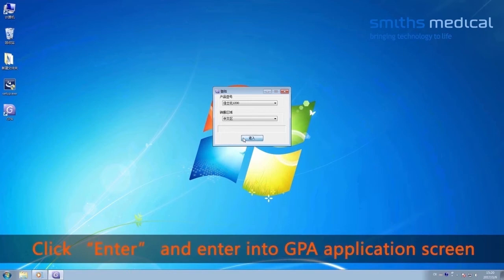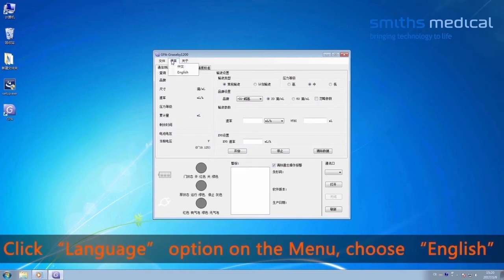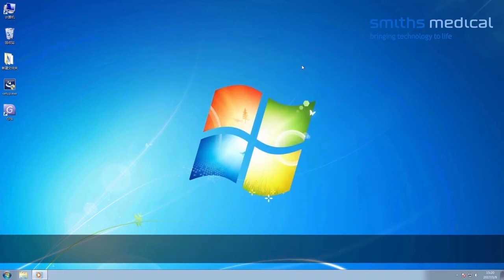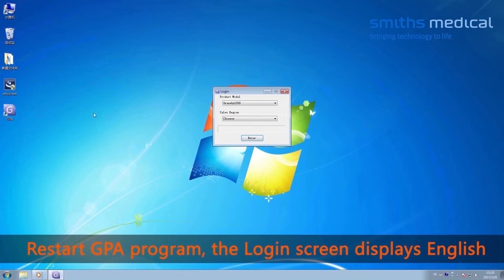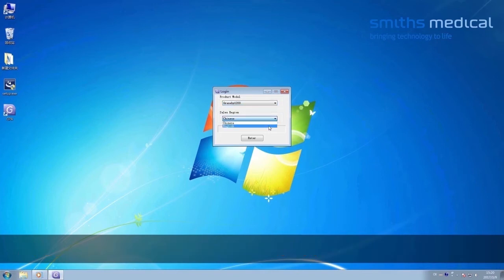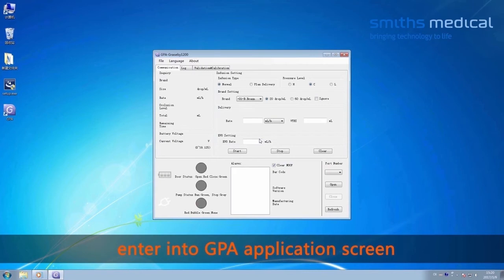Click Enter to enter the GPA application screen. Click the language option on the menu and choose English. Log out of the GPA program and restart it. The log screen now displays in English. At the logo screen, select the product model as Grass B1200, select the sales area as English, and click Enter to enter the GPA application screen.